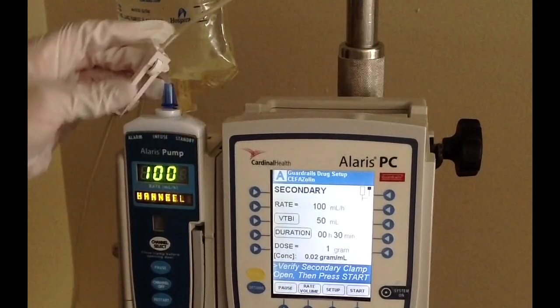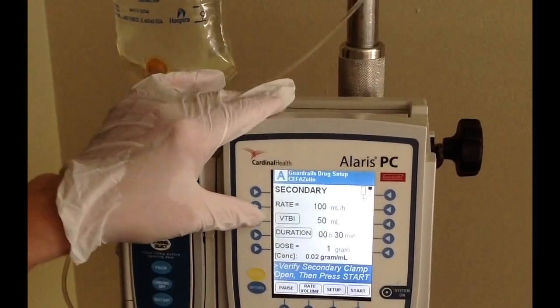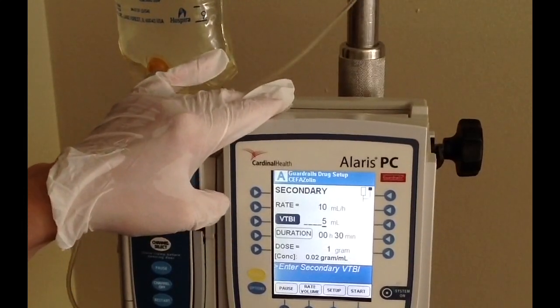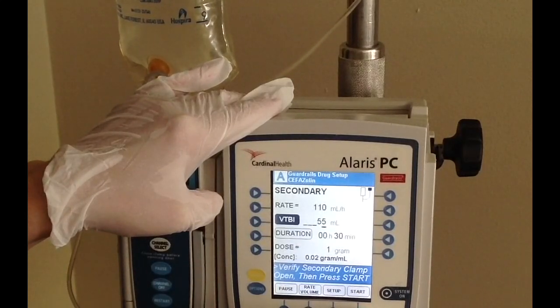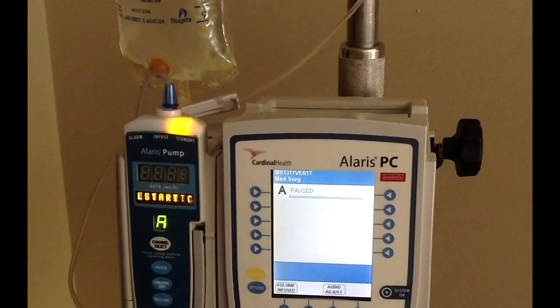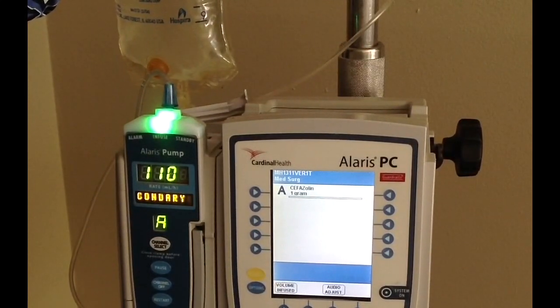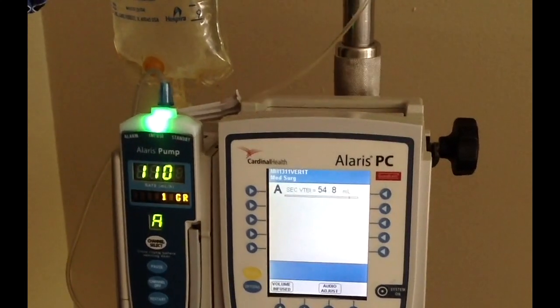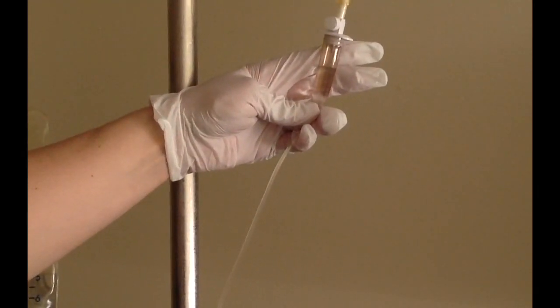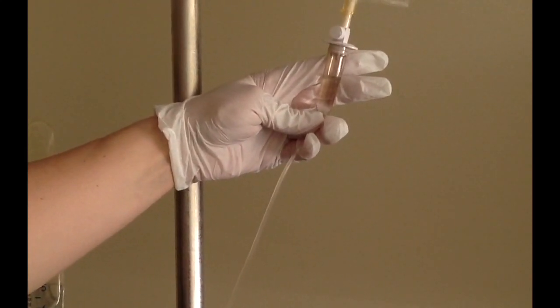If you wanted to change that volume to be infused to be 55 mils, you can go ahead and click the VTBI and punch in 55 mils to match what the bag says. It's going to recalculate the rate for you, and you can at this point hit start. If you note the marquee, it's going at 110, and it's scrolling across the actual drug. If we pan up to take a look at our secondary, we want to watch that secondary for a total of 3 drops before we leave the patient's room. And there's the 3rd drop.